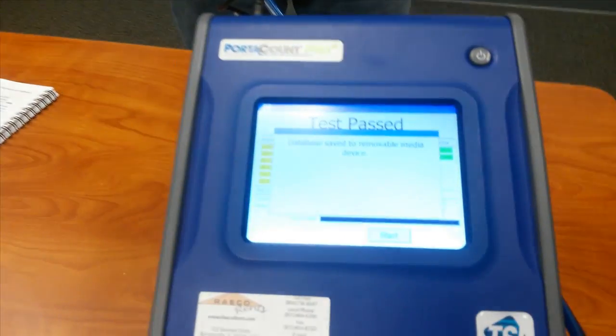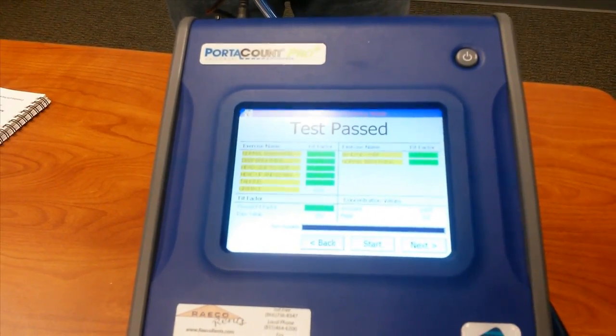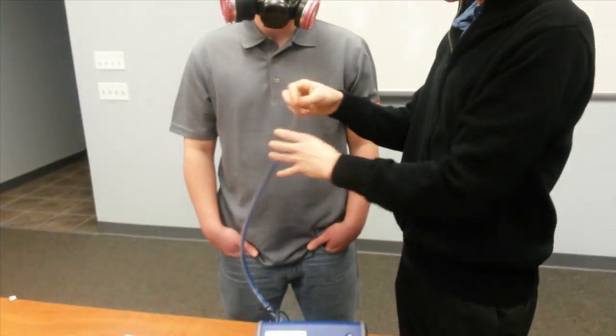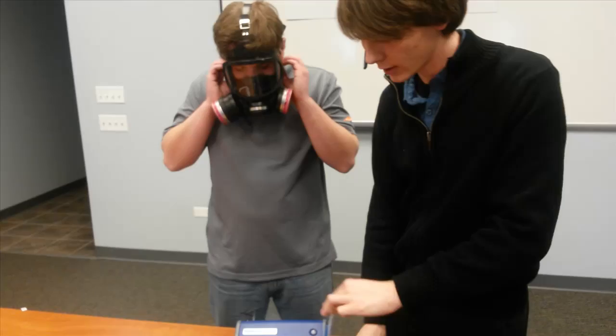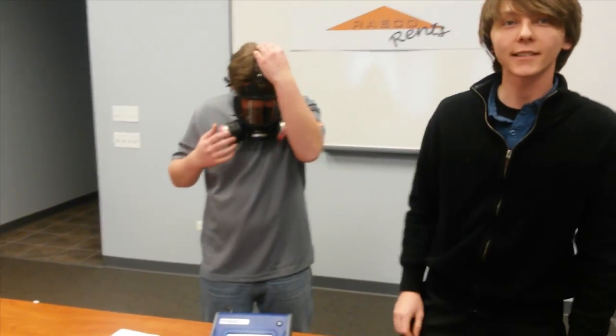Now that it's finished, it's going to save the results onto the database that you selected. Go ahead and disconnect the clear tube from the respirator, remove the mask, and that's how you run a fit test on the TSI PortaCount.